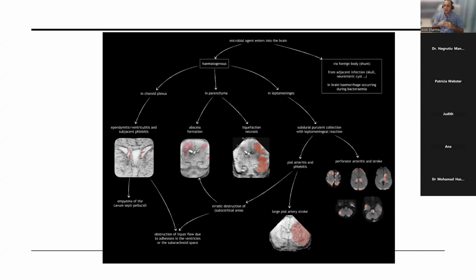So I will be uploading a video today which talks about interpretation. So we've done a stepwise approach to the protocol. I've shared that video with you of performing ultrasound. But really, there is a 10-step approach to interpretation, which basically talks about going from outside in.